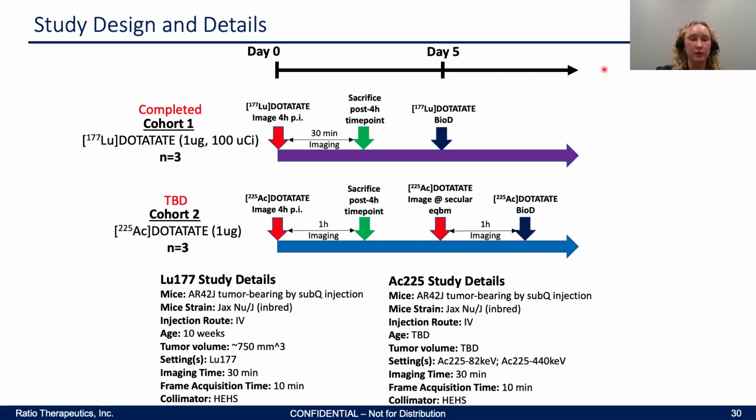And then we also planned to do this similar study with actinium-labeled DOTATATE. We have not been able to do that yet purely due to actinium availability limitations, which I'm sure a lot of people are familiar with, has been a global phenomenon, especially this summer. So we're still waiting to perform this second portion of this study, but I'll still describe it because it'll put into context why the lutetium study was performed the way it was.